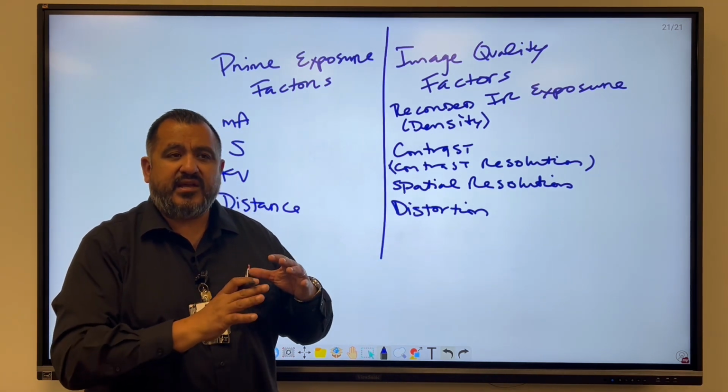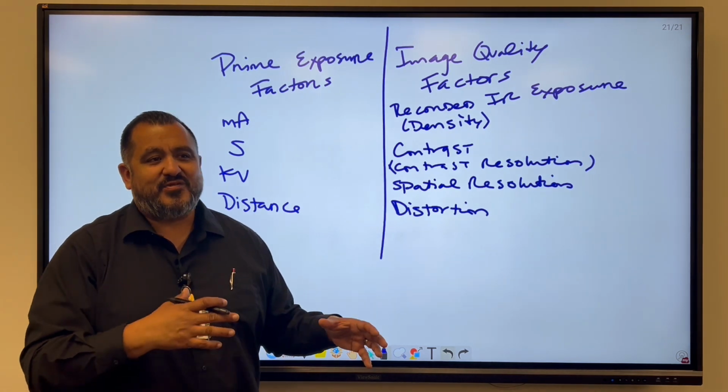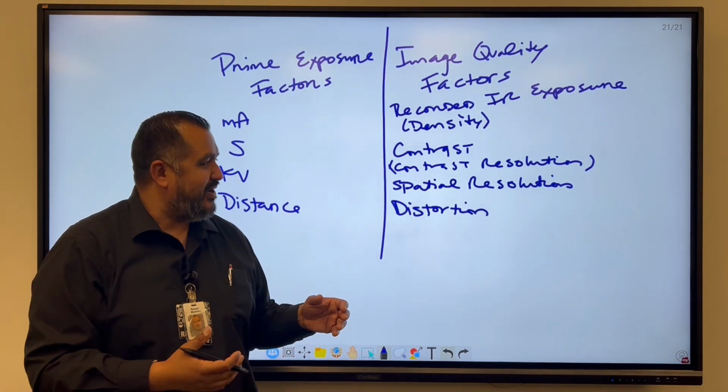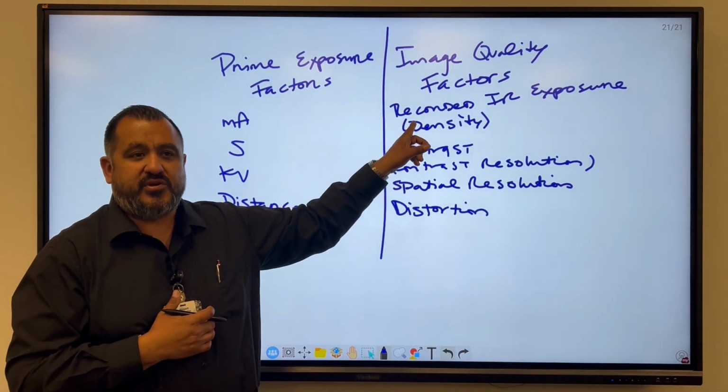And there's some things we can't get away from, but that's, again, I love working in radiography because you got so many things working against you that you're trying to create something good out of it, right? So I like the challenge. But today, I'm gonna focus on recorded exposure.